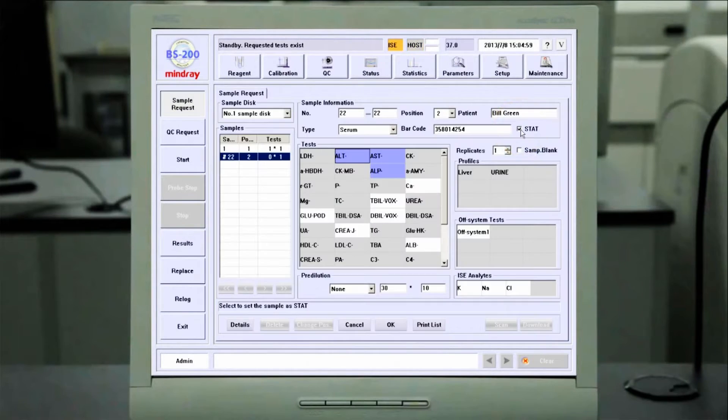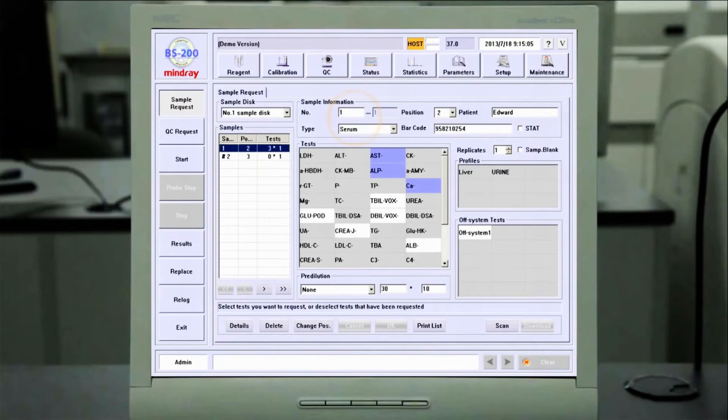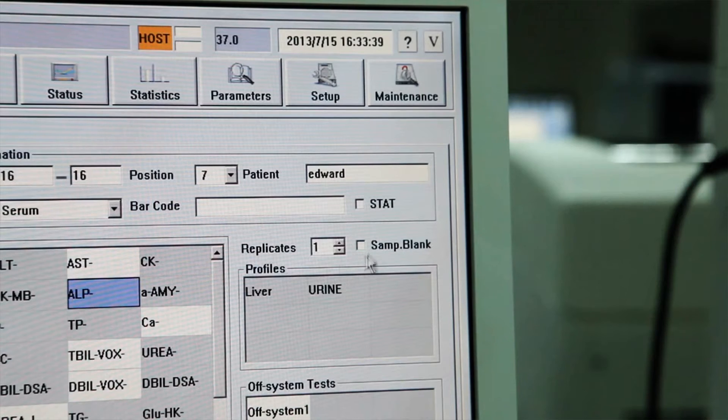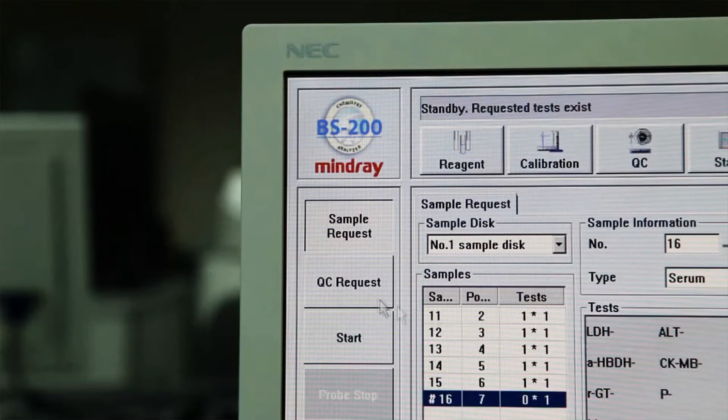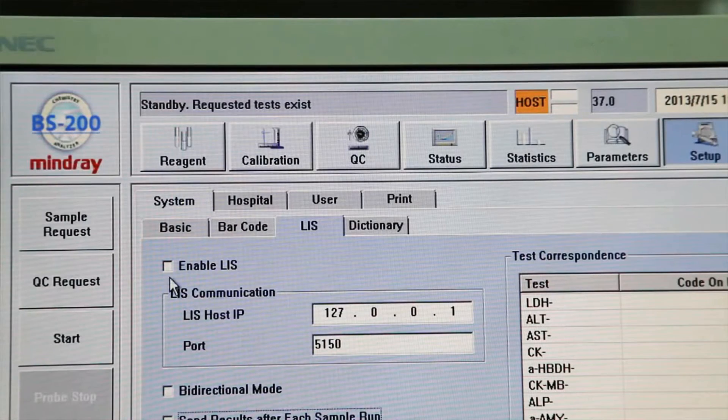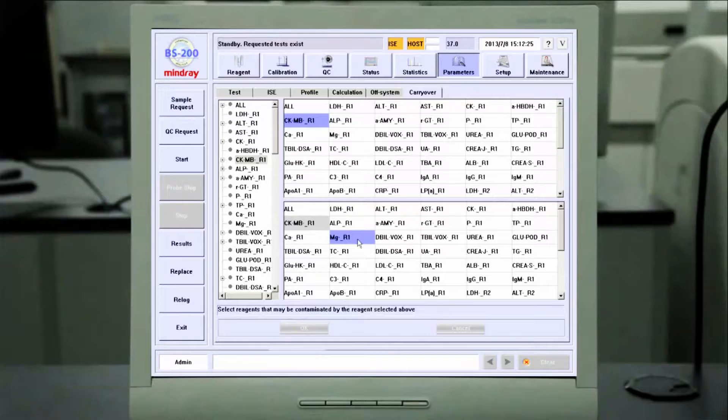The BS200 software supports STAT, routine priority, and batch testing. The STAT samples may be programmed in the sample request screen or through the LIS system. The BS200 software offers a unique carryover prevention function. It minimizes potential reagent carryover and ensures utmost result accuracy.